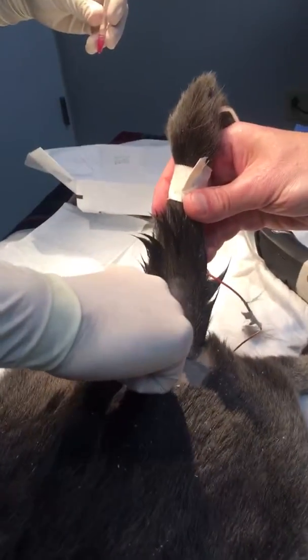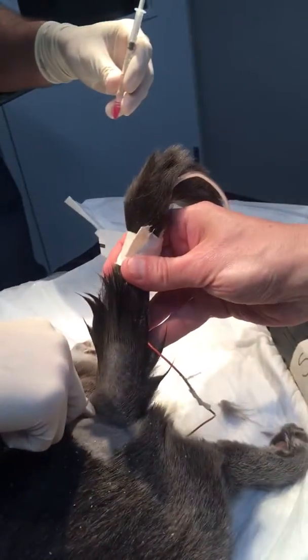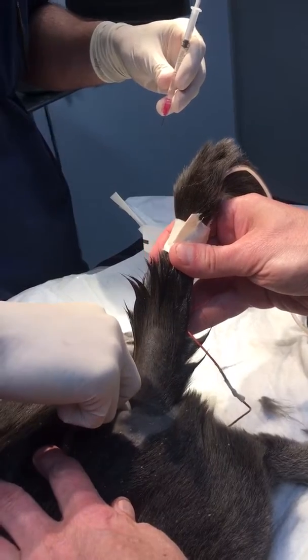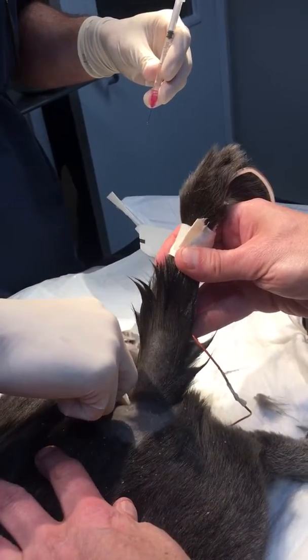So you're going to put your finger. And you go on midline, and this is a big cat, you're going to have to go sink it, and you'll feel yourself slowly — if you're hitting bone, walk off it. Can we have your drugs for the next one?